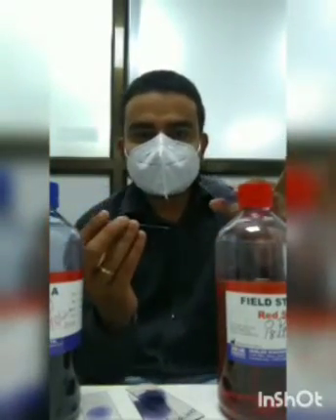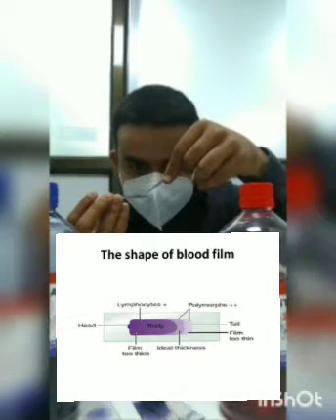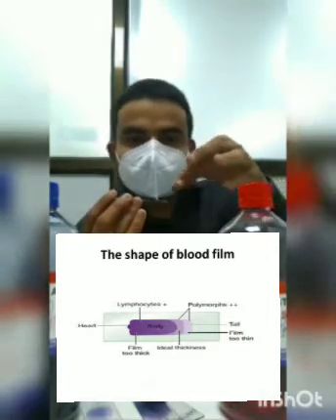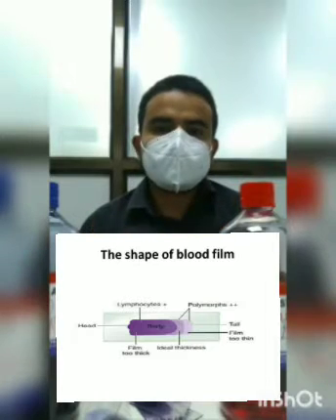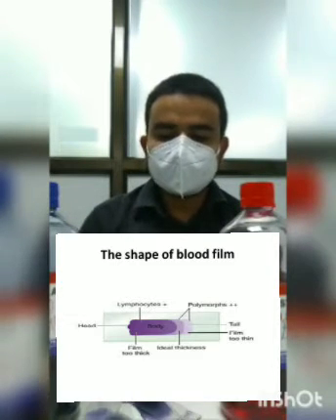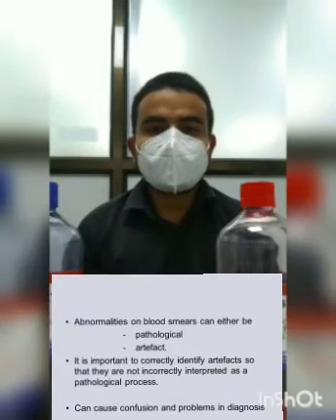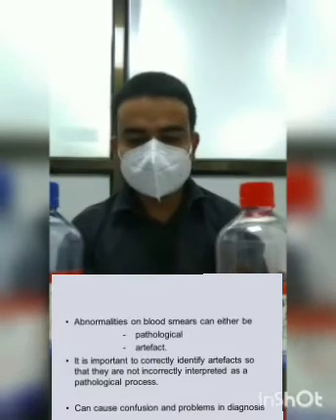Some precautions have to be taken, like not applying too much pressure. The angle of the other slide that we use to make the smear should be around 45 degrees. We have to prepare a smear that is not too thin and not too thick. If it is a thick smear, all the cells will overlap and we cannot comment upon the morphology properly. If it is a very thin smear, it may give us false data regarding the total counts. A very thin smear will happen if we apply too much pressure, and there will be tailing.